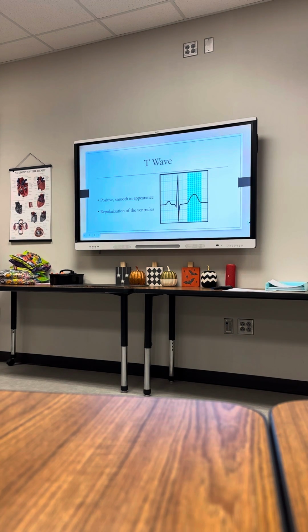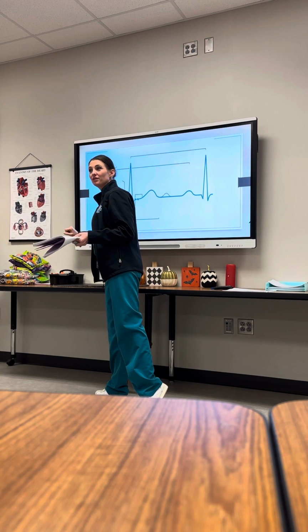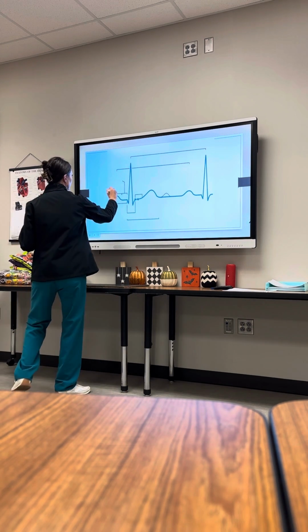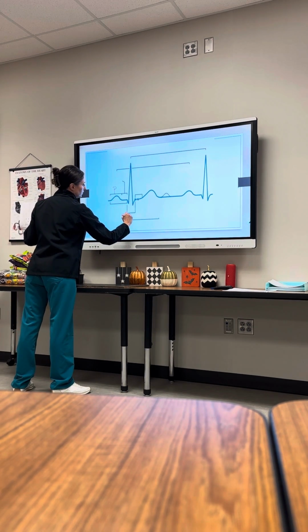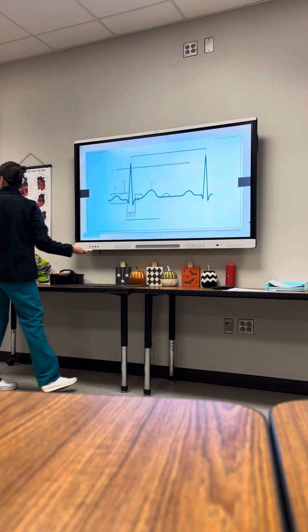I'm going to give you a couple extra things with the T-wave here. Okay, you ready? No, we're gonna label it first. I forget. Okay, let's label it real quick. So P, Q, R, S, and then you've got your T wave there. Okay.